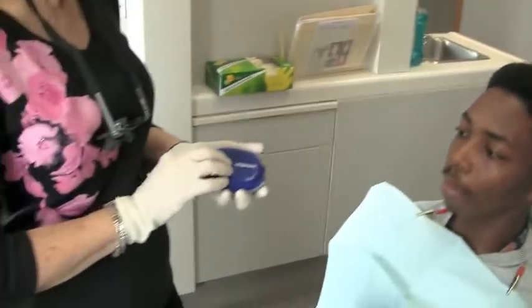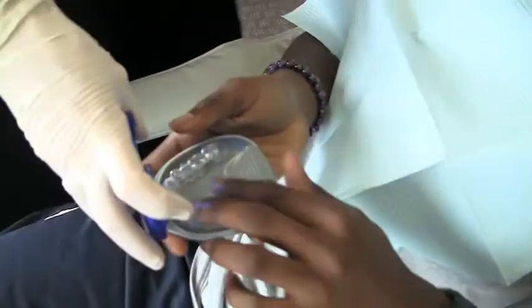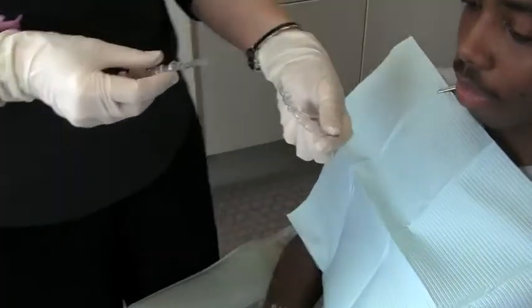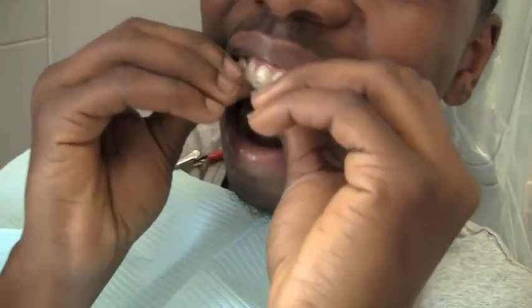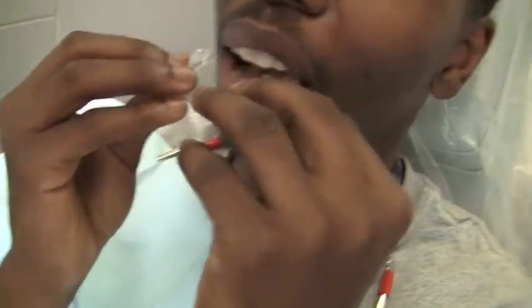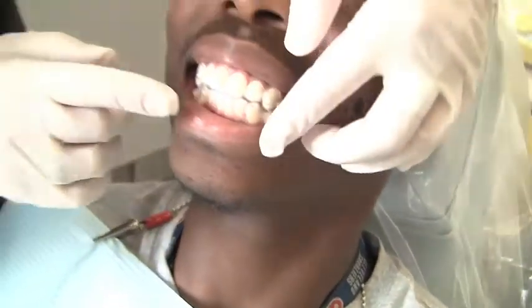Thank you. Very good. Now, we're going to give you some new aligners. Okay. You can put the old ones in here. And aligners here. Thank you. All right. There's the bottom ones. Thank you. Great. Okay. Good.